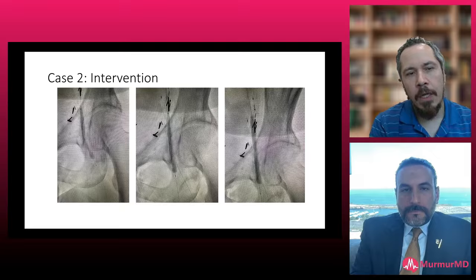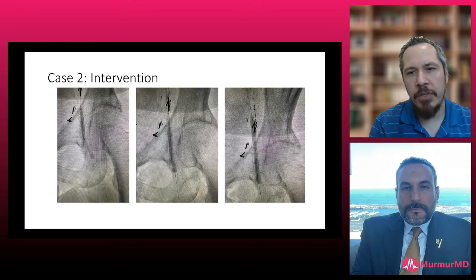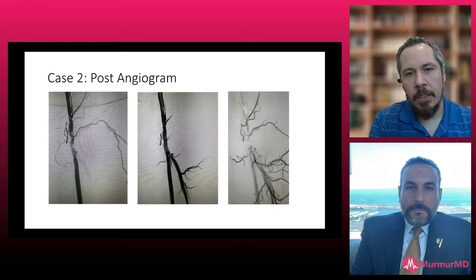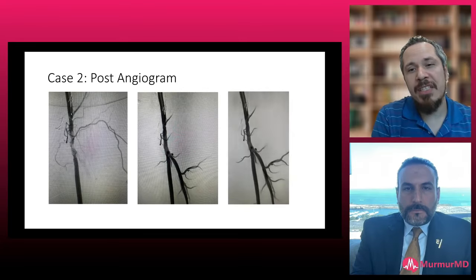I think that technology has really changed the way I work in areas like popliteal, below the knee, common femoral, profunda, things like that. I think it works really well. And then we finished with a DCB, and I'll show you the pictures before and after. Beautiful. Yeah, so I think the technology is here. I think we just need to know how to use it.